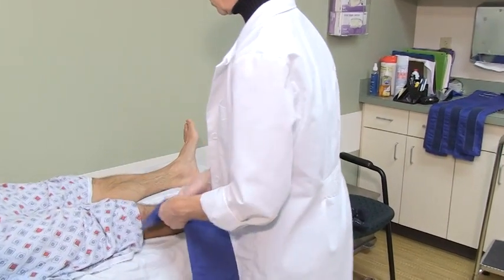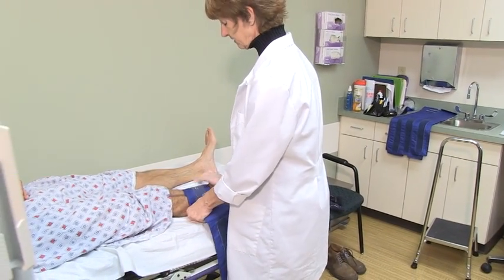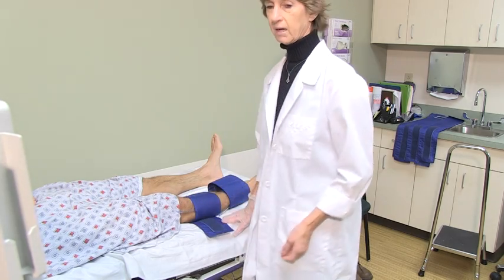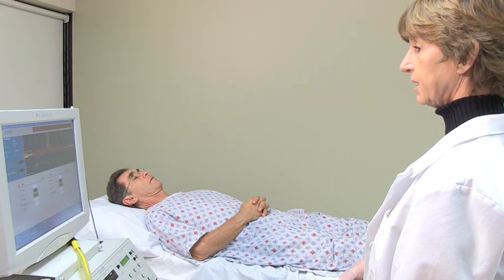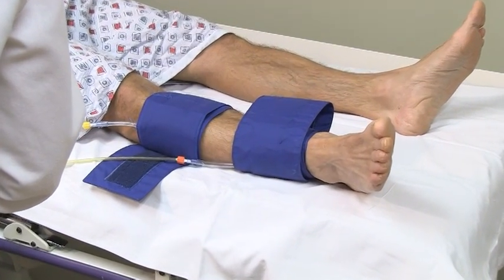They will then place blood pressure cuffs on your legs, arms, feet, and possibly toes. Two measurements will be taken with the blood pressure cuffs. The first measurement, the cuffs will pump up slightly. The second measurement is a blood pressure and will be slightly tighter. This is just the same as taking the blood pressure in your arm.